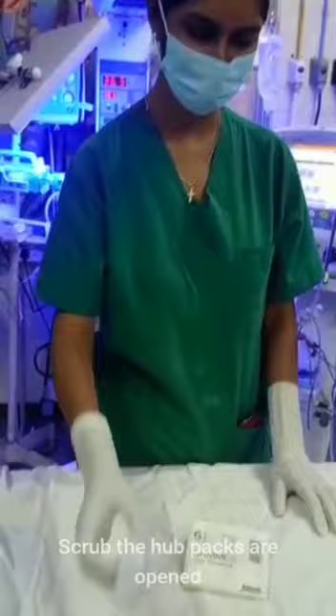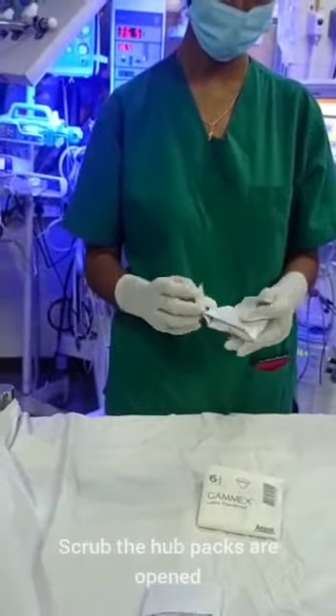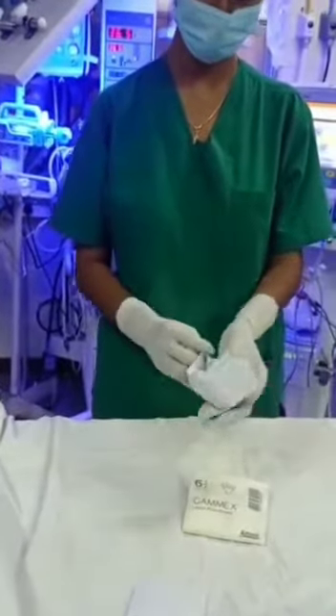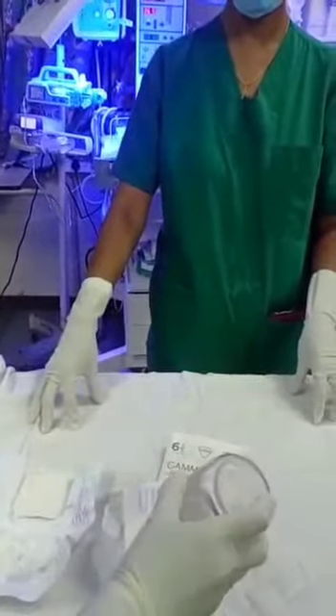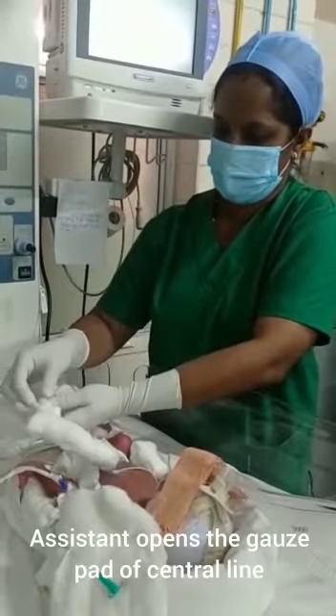The scrub the hub packs are opened. The gauze in the scrub the hub pack is retrieved, and the assistant opens the gauze pad of the central line.